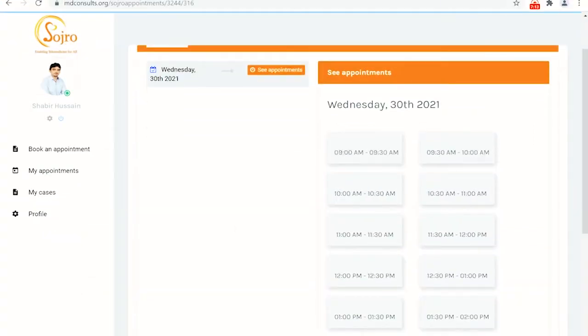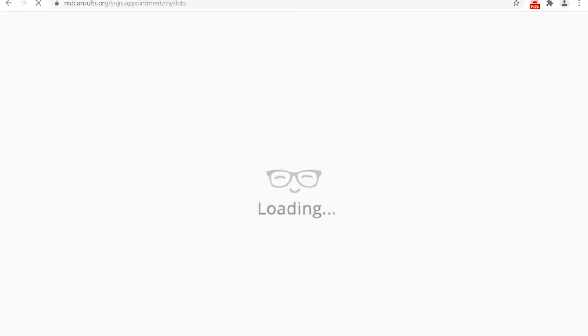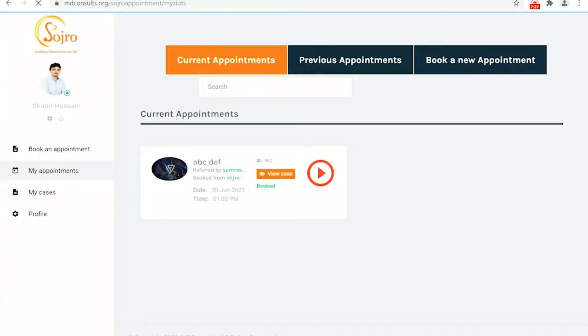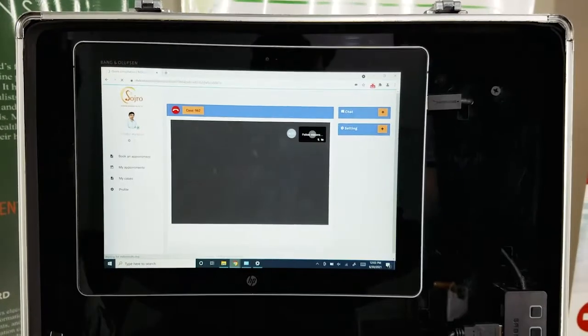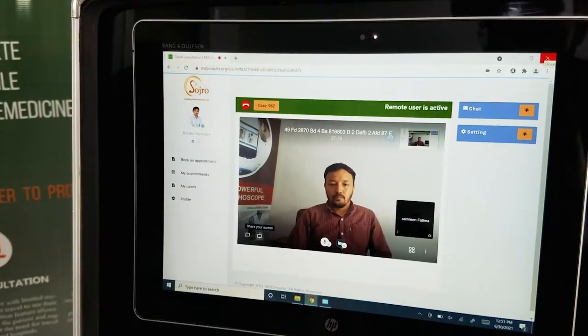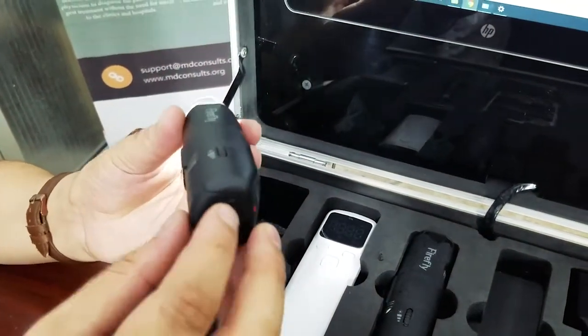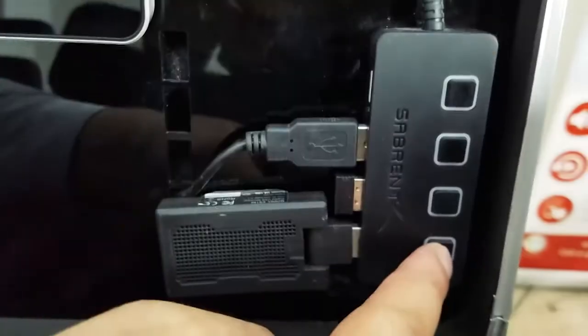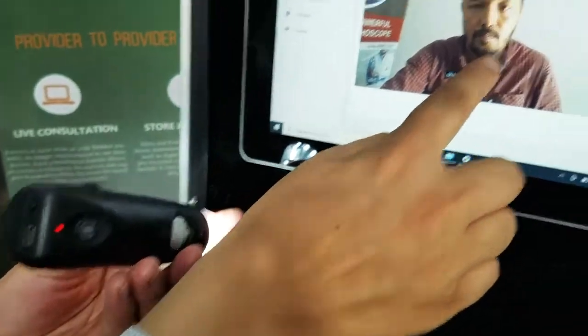Look at the available appointment slots and book an appointment. When the appointment is clicked, you can connect with a remote physician for a live consultation. During a live consultation, you can connect the wireless devices just as shown on the screen.